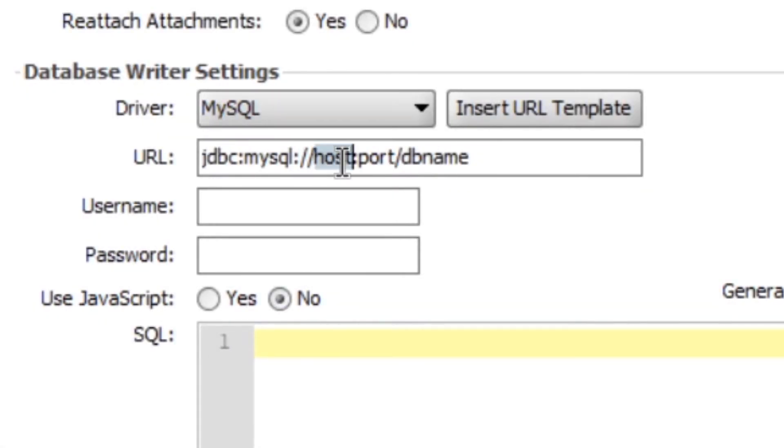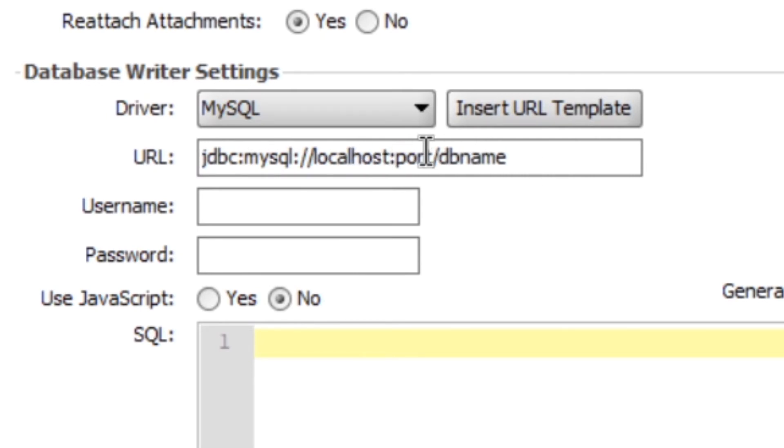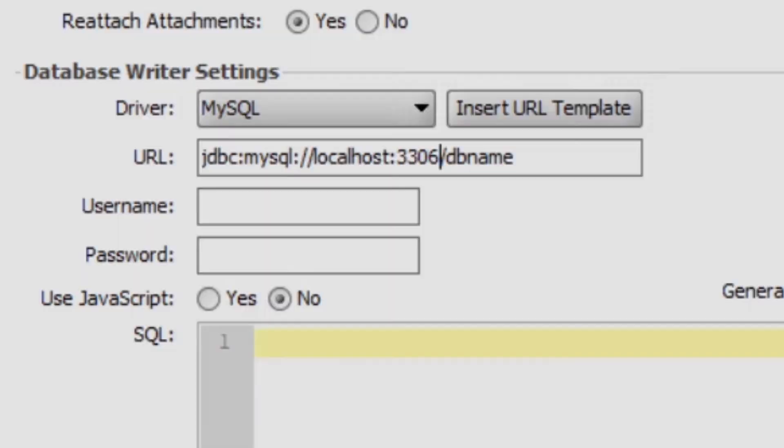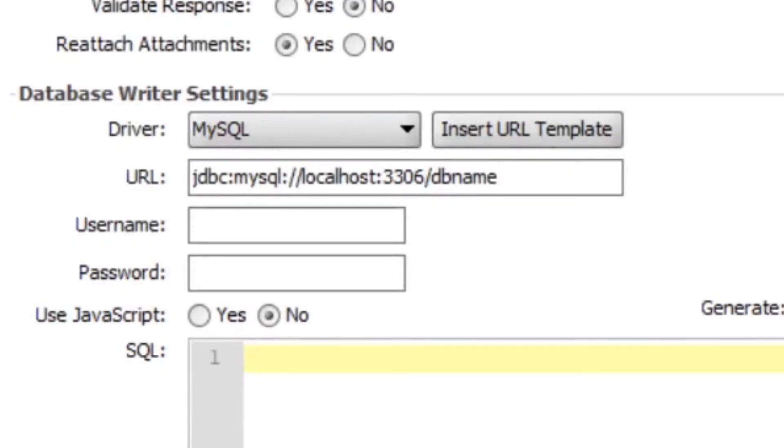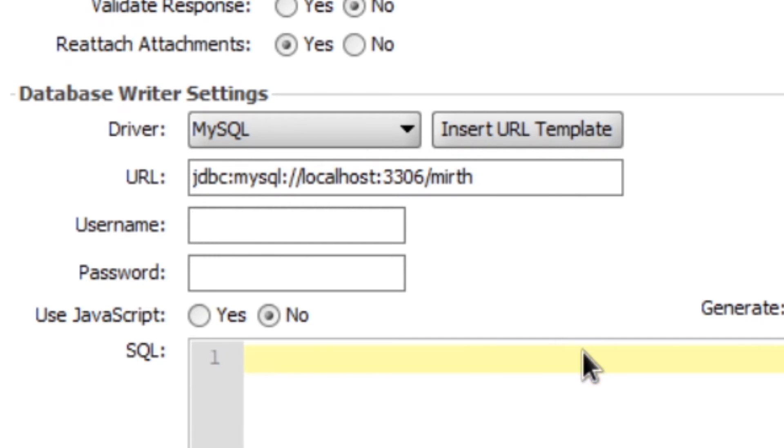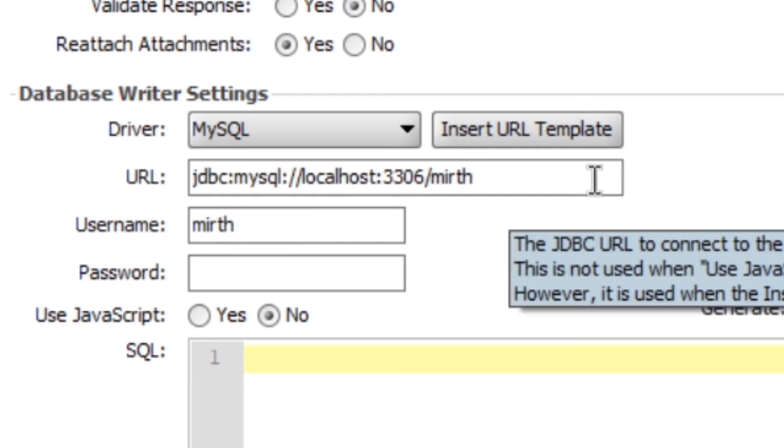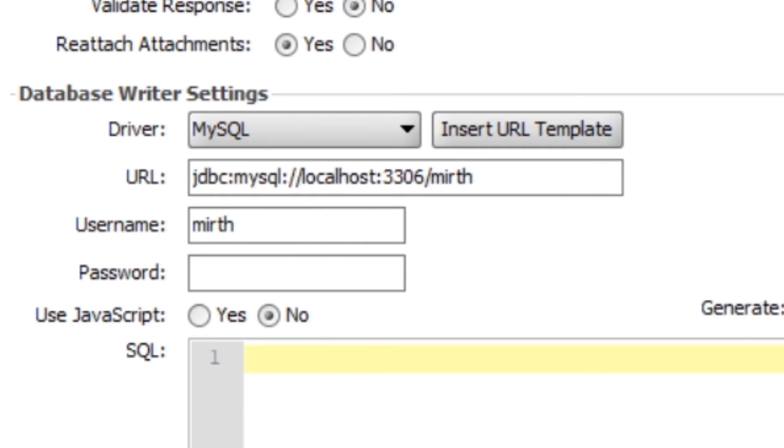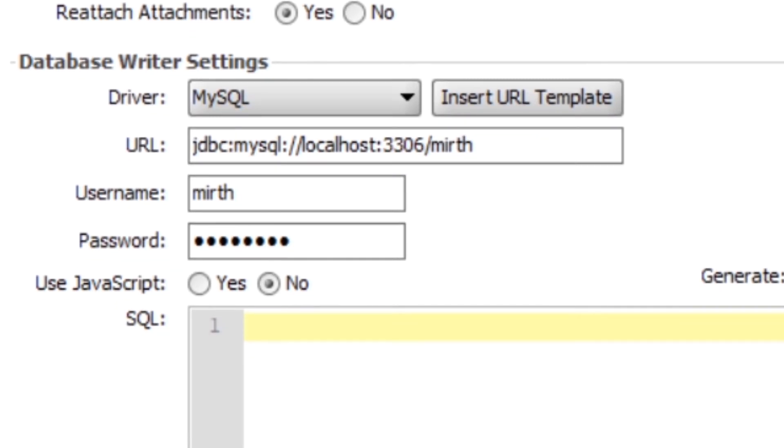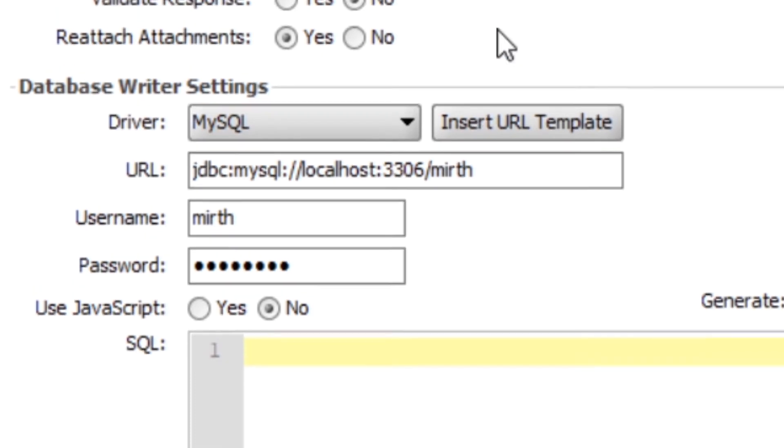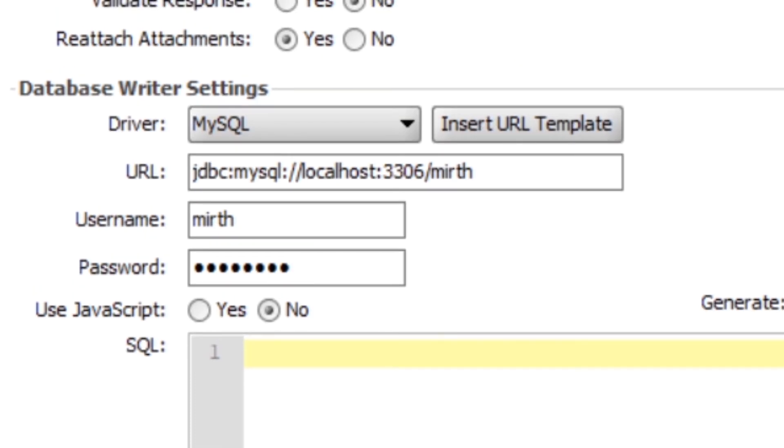So we want to change host to localhost, since it's talking to itself essentially. And port, we want to change to 3306. And then under db name, we want to change that from db name to mirth. And then under username, we want to enter in mirth. And then the password for the mirth SQL user, which we set up during the database setup. In this case, I left it as just password.